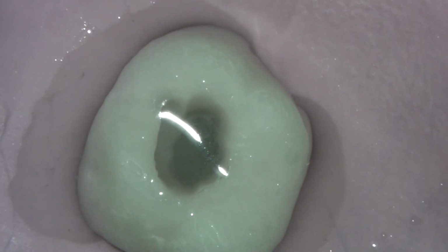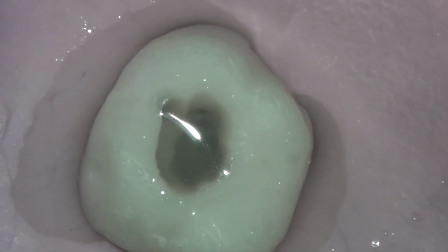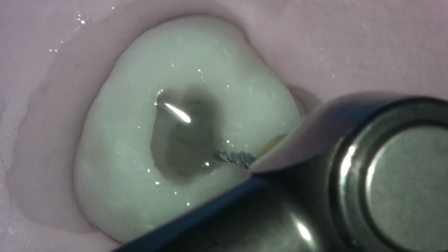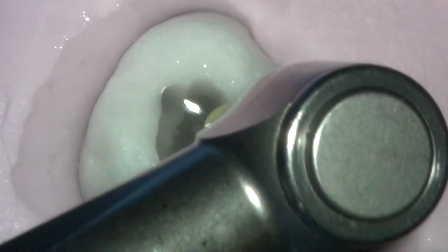Don't rush this. You don't have to establish patency. You can do it in a number of passes. We can go back in with our rotary file, make sure it's cleaned in the sponge, and we can then work our way down into this apical portion of the root canal system. So again, we go in and we're going down a little bit further.